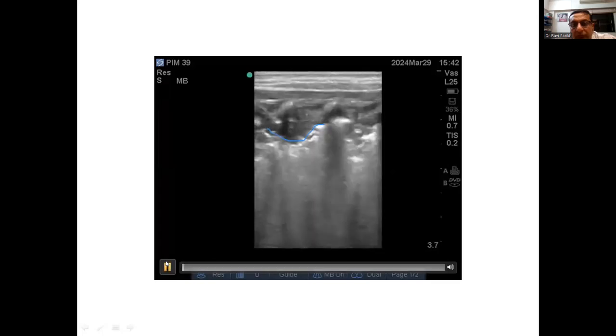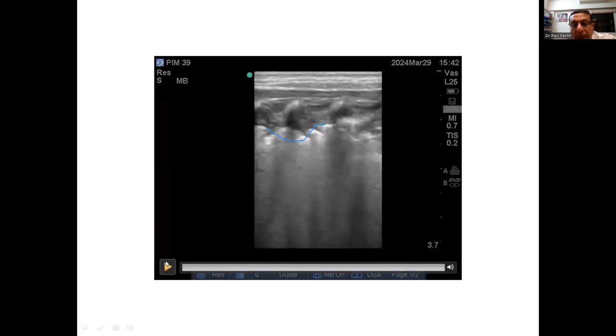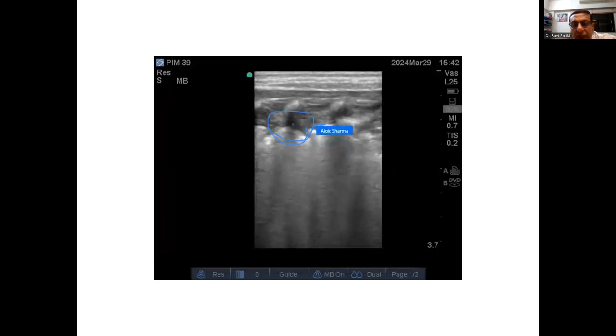Again, with atelectasis, we said that in the area where the lung is completely atelectatic, you're not going to see blood vessels within that region. So again, using Doppler here is really helpful. For me, again, the clinical history would be very important. So the CRP, what you might be growing on ET secretions or blood cultures.